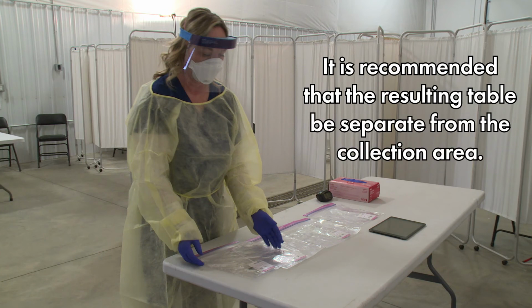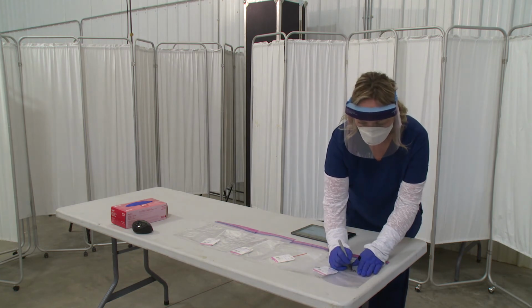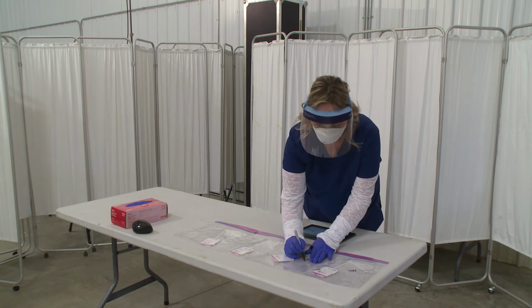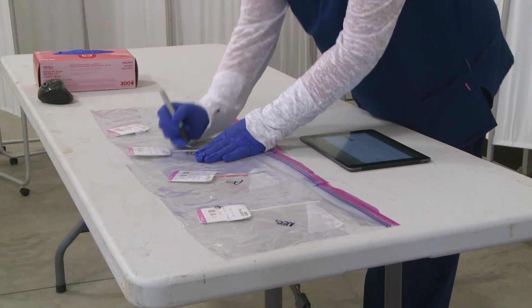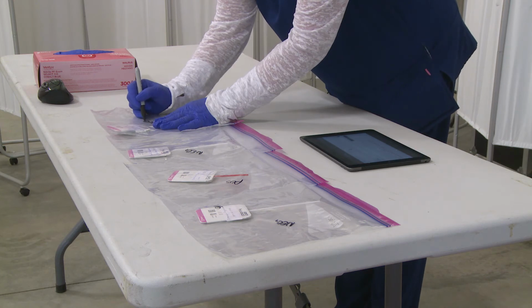We really encourage that your resulting table is separate from your locations of collection to provide privacy and protect people's information, because it is quite easy to see names and results within these test cards. So we really encourage, again, that it is a separate location. The facilitator who would be reading the results for the BinaxNOW test kits would need to read those results within 15 to 30 minutes of collection. So 15 minutes after the time of collection and before 30 minutes after the time of collection is the time allowed for reading the BinaxNOW test kits.